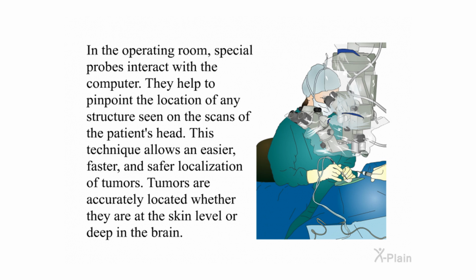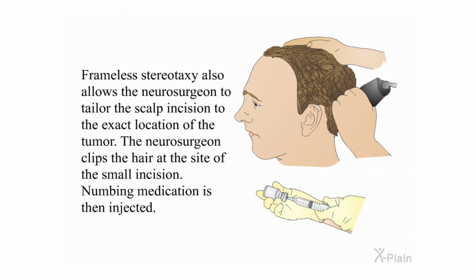In the operating room, special probes interact with the computer. They help to pinpoint the location of any structure seen on the scans of the patient's head. This technique allows an easier, faster, and safer localization of tumors. Tumors are accurately located whether they are at the skin level or deep in the brain. Frameless stereotaxy also allows the neurosurgeon to tailor the scalp incision to the exact location of the tumor.